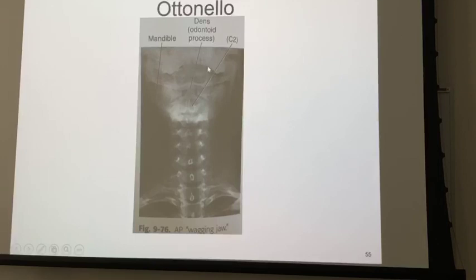So what positioning error do they have here? The neck flexed or extended? You're positioning right. It's just, what's the word? Is that flexion or is that extension? Flexion. That's extension, actually. Oh. Yeah.